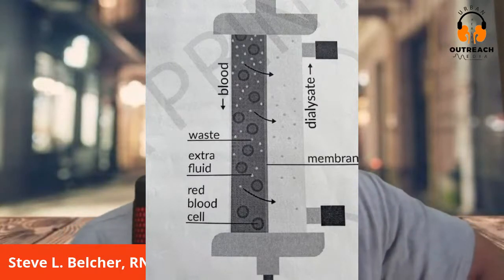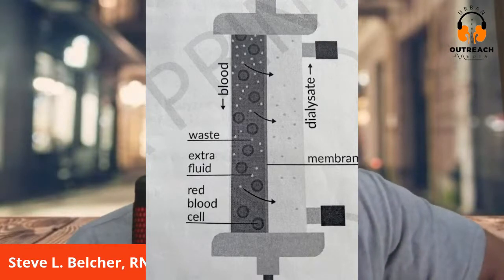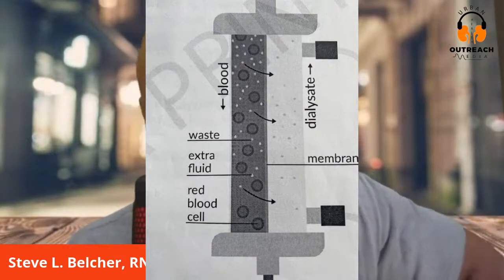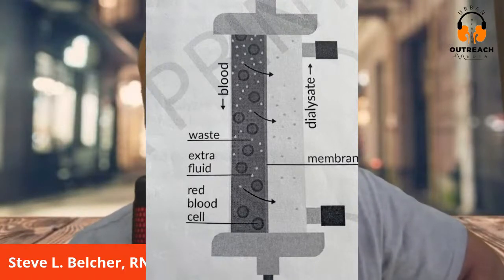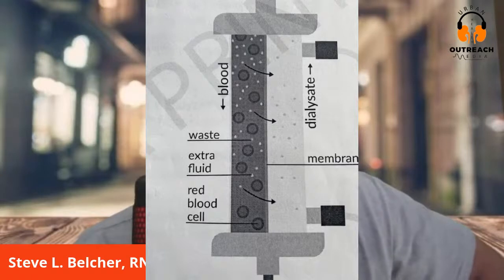Where you see blood, you see waste, extra fluid, and red blood cells. Now, red blood cells don't cross that membrane because those cells are large, but the waste and the extra fluid cross that membrane by a process called osmosis and diffusion. Okay.